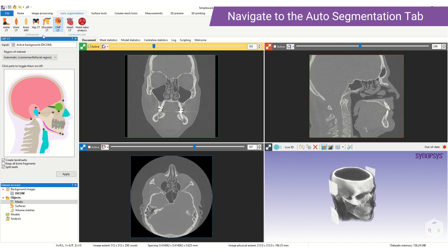AS Ortho includes ankle CT, knee CT, knee MRI, hip CT, shoulder CT, and now CMF CT.